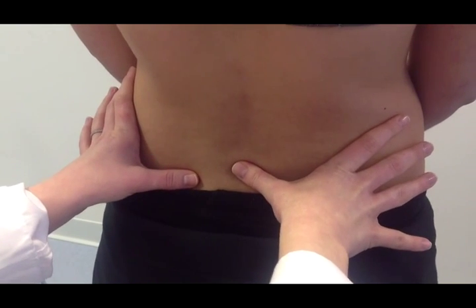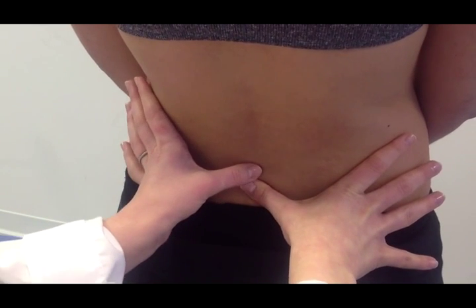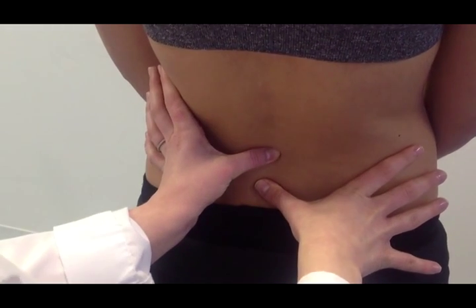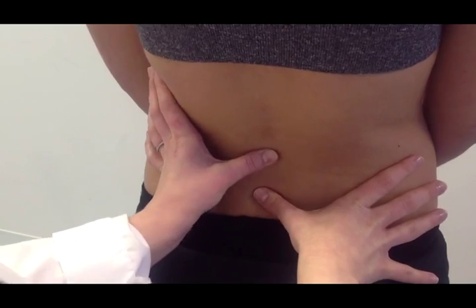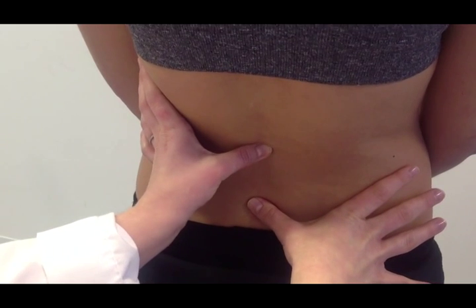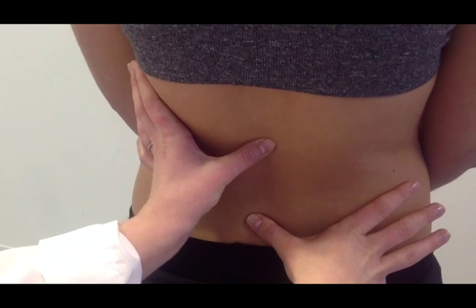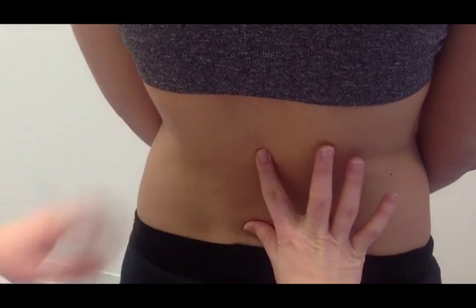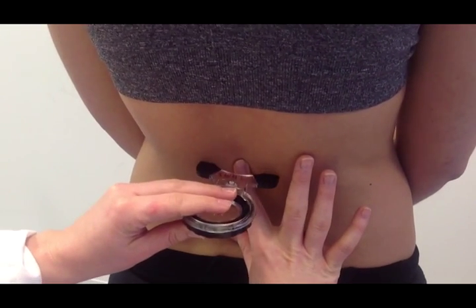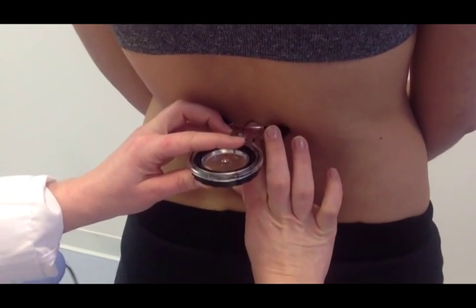To locate T12, you can count up vertebrae. So if my thumb is at S1, the next vertebra up will be L5, L4, L3, L2, L1, and finally T12. I'm going to mark my fingers. Then I'll straddle the first inclinometer over the spinous process of that vertebra at T12.